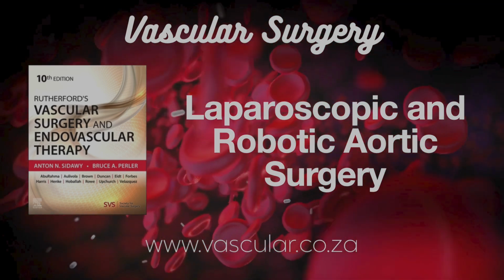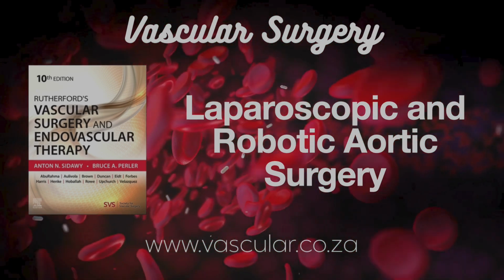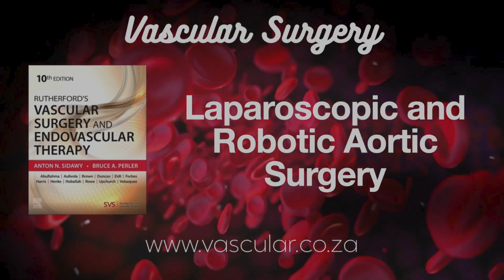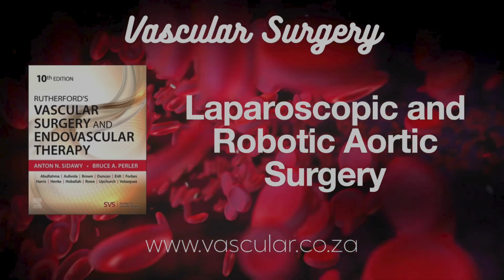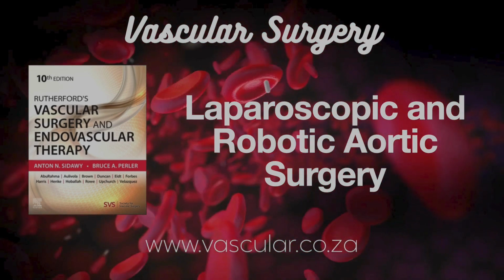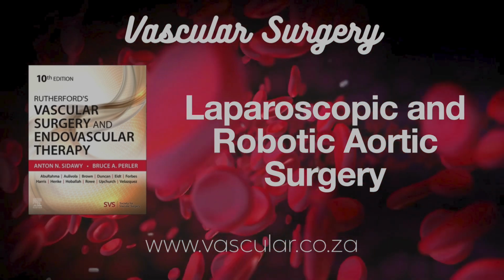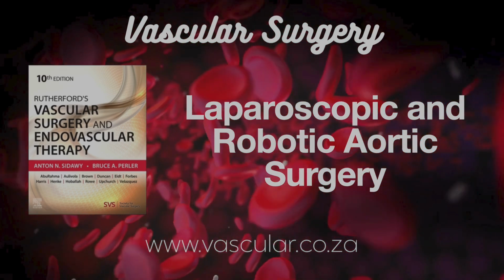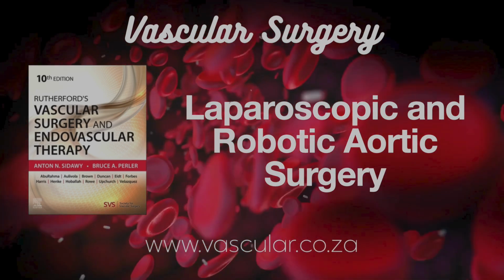Totally robotic aortic surgery and robot-assisted procedures. What's the big draw with robots here? Dexterity. That's the headline. Robotic instruments have like 5 to 7 degrees of freedom, way more flexible than standard straight stick lap instruments. So they can bend and rotate like a wrist. Exactly, much more like a human wrist. Combine that with amazing high-def 3D vision inside the body. Wow. And it potentially makes complex stuff like suturing deep down easier to learn and execute really precisely, more intuitive.